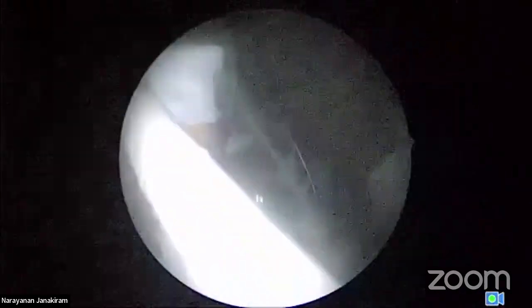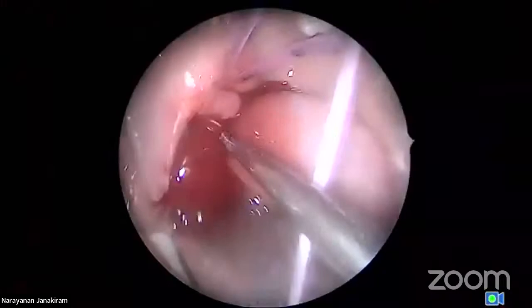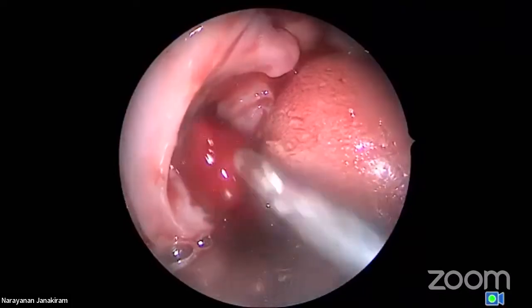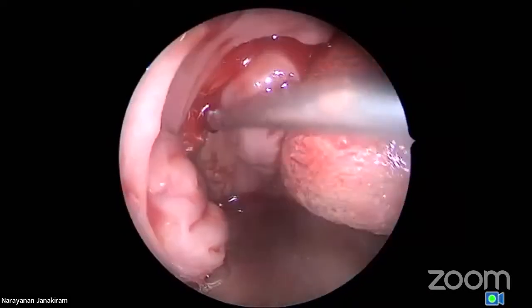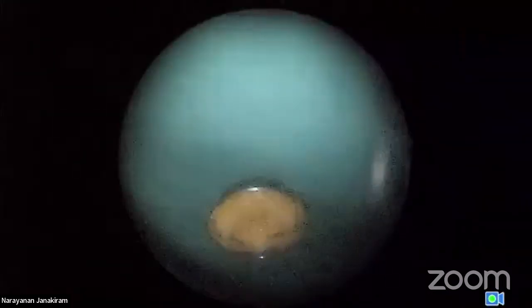Now you see what I do is, there's no good mouth opening also. Wait. Okay, suction. So this is the stage 1. The stage 1 is you completely debulk everything. See the adenoid, it's almost kissing adenoids. See that? It's very big adenoid. So what I've done is just pack the nasopharynx, sorry, and just wait, okay? And now keep irrigation. Keep irrigating the nose.